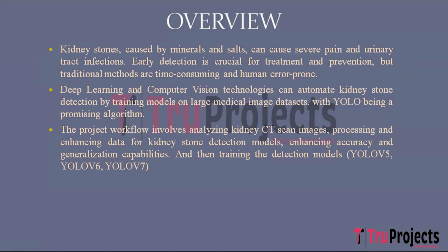So these steps form the foundation for robust model training, improving the accuracy and generalization capabilities of kidney stone detection models. And these pre-processed images are used to build the detection models YOLOv5, YOLOv6, and YOLOv7.